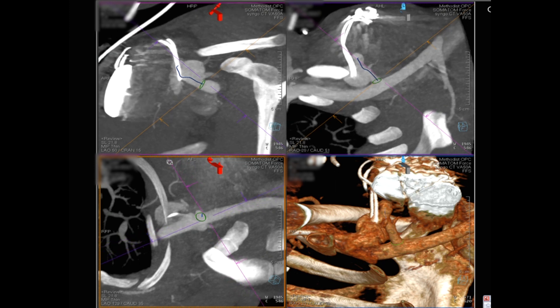Reconstructed CTA images enabled good visualization of the fistula and were used to select the optimal C-arm angulations and to plan the procedure.